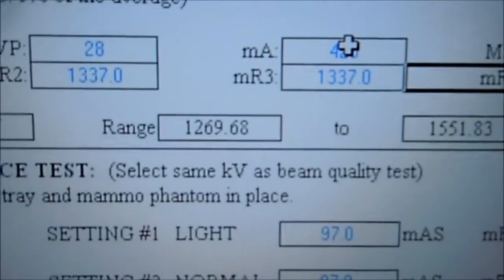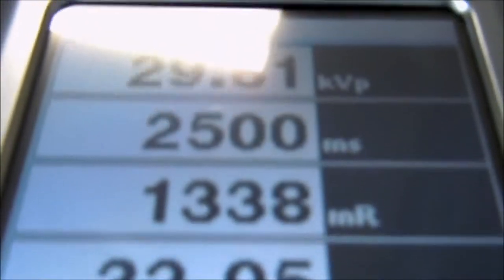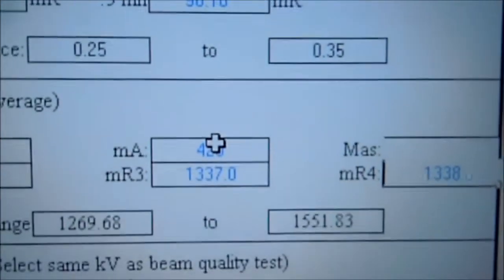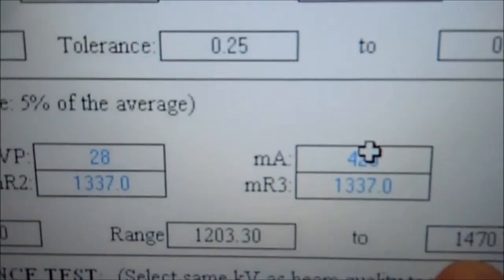We're going to take the fourth one using the same techniques, measuring 13.38, and we enter here 13.38. Then we just look at the average, which is 13.37. It has to be between these two parameters, which it is.